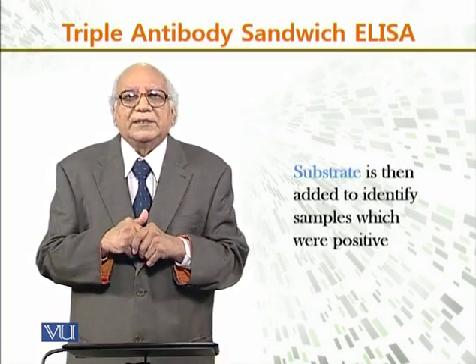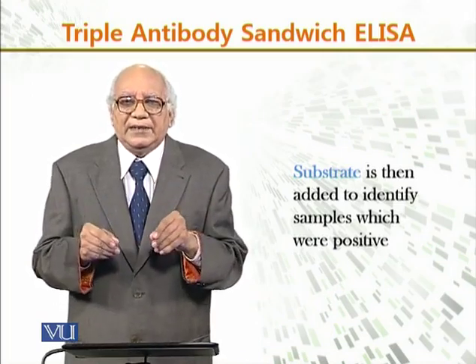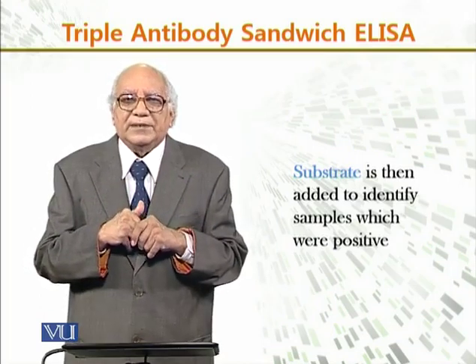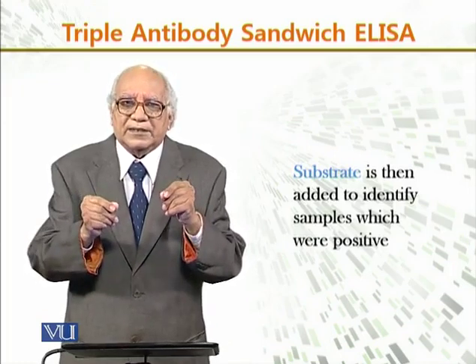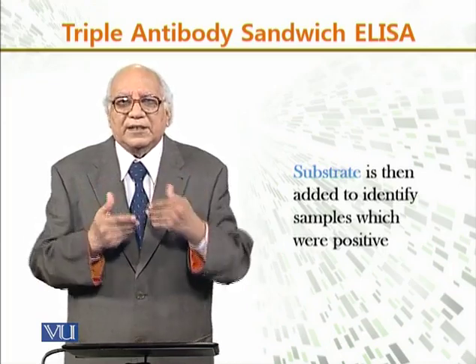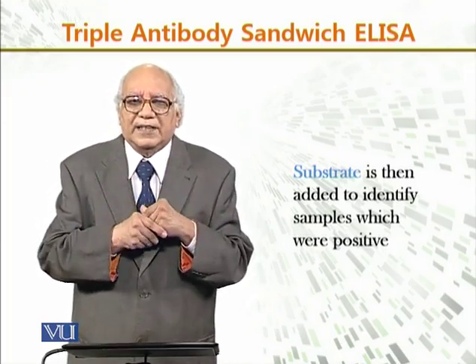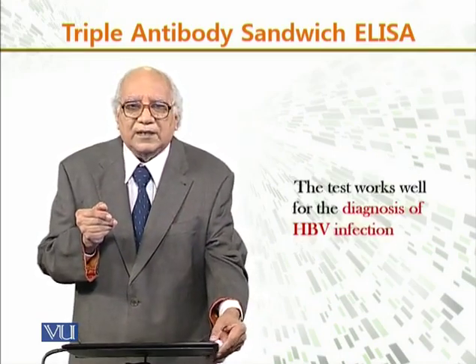Now substrate is then added, since we have added the enzyme, to identify samples which are positive. The marker enzymes will indicate, through a color reaction or some other method, whether that antibody is present or not.